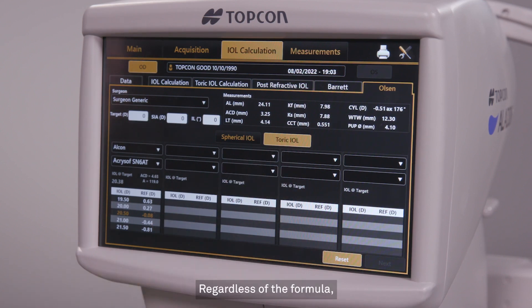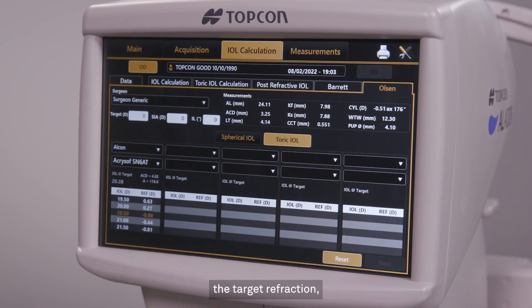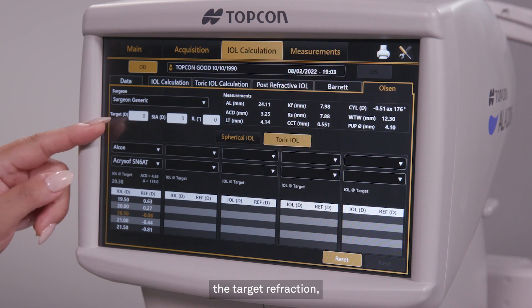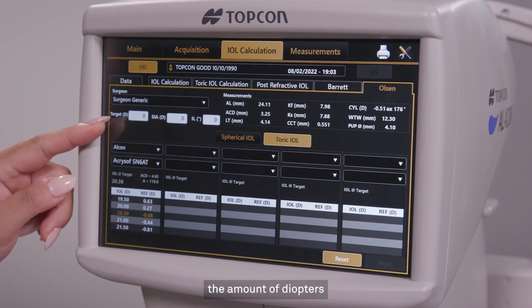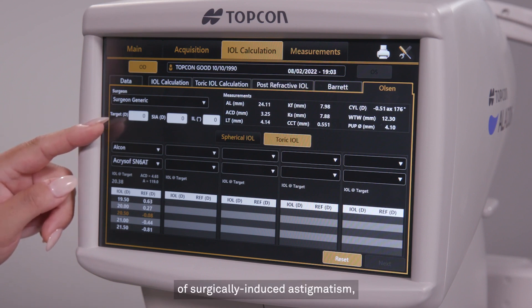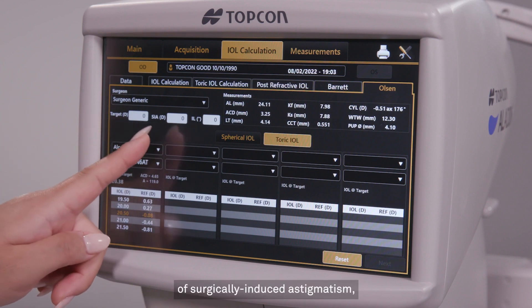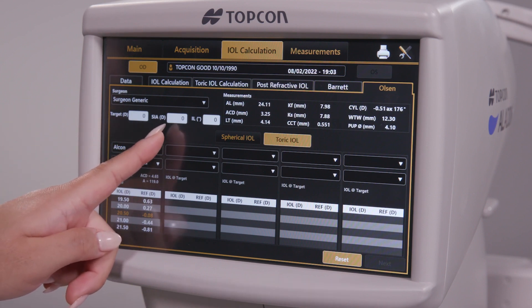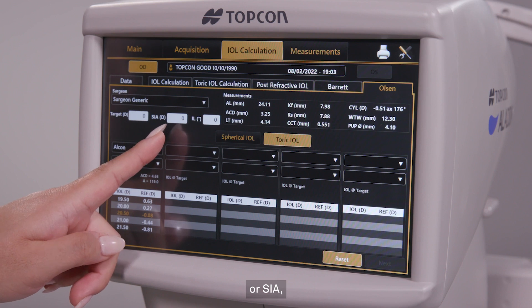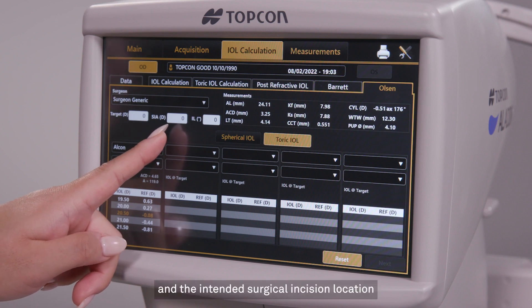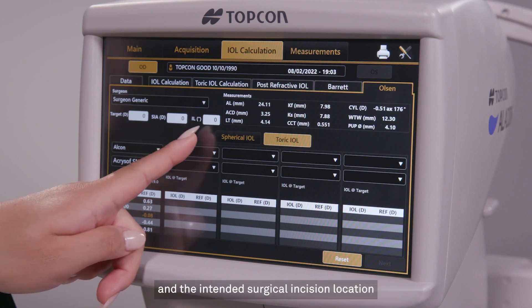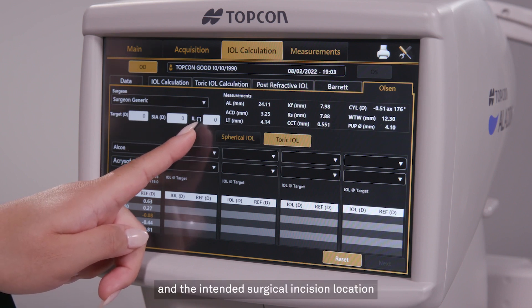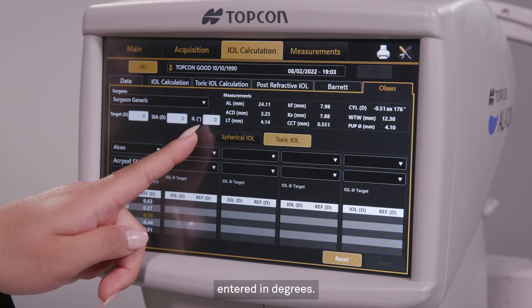Regardless of the formula, you will be asked to confirm the target refraction, the amount of diopters of surgically induced astigmatism, or SIA, and the intended surgical incision location entered in degrees.